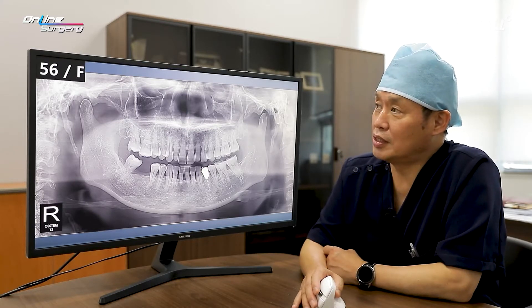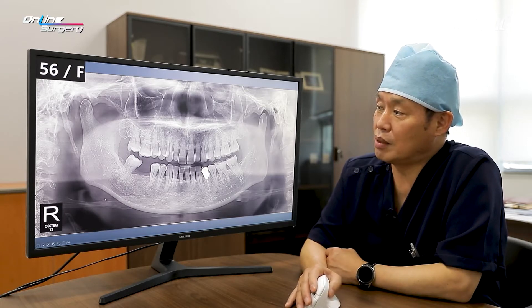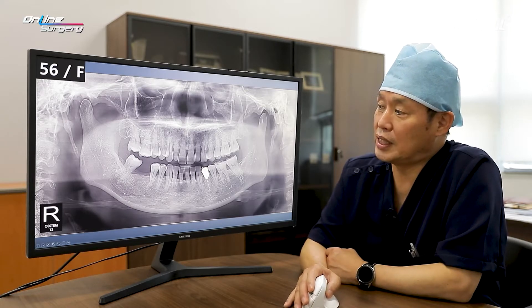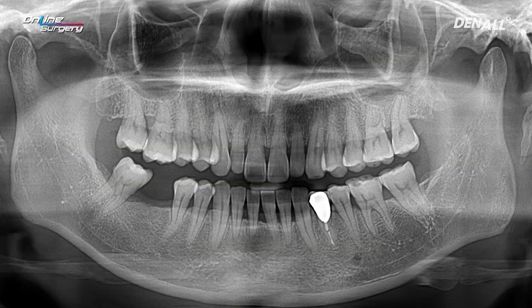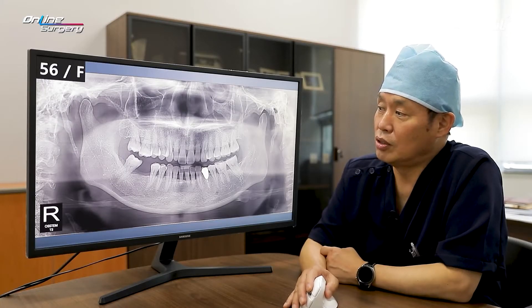Today's patient is a 56-year-old female patient. There's no systemic disease. This is the panoramic image at the initial visit. Extraction was done one year ago. If you look at the missing area in number six, the distal tooth is mesially tilted. In this case, orthodontic treatment may be needed to upright it.